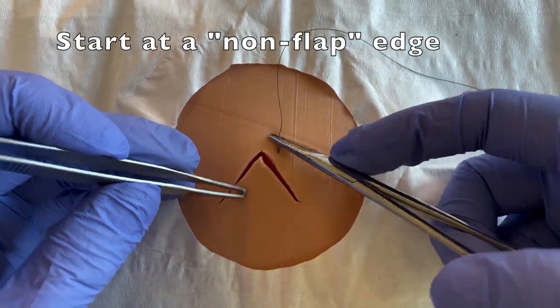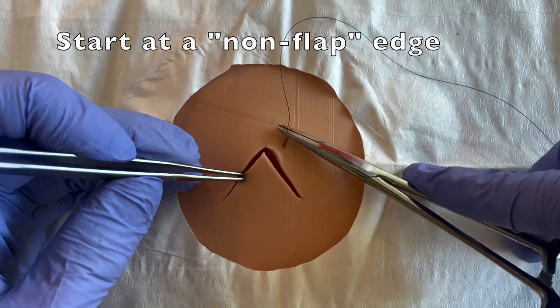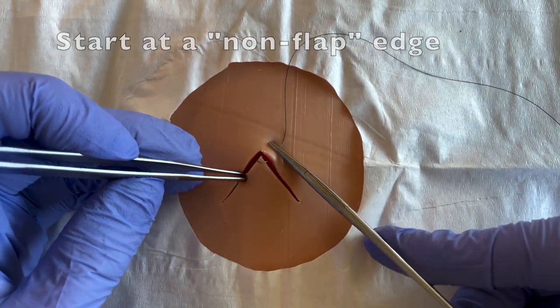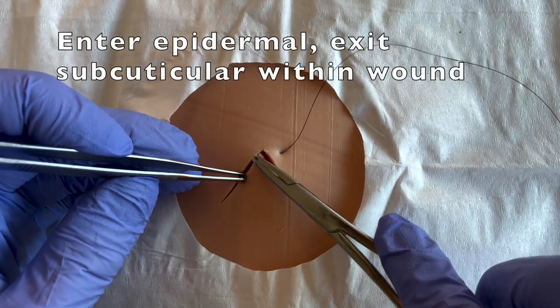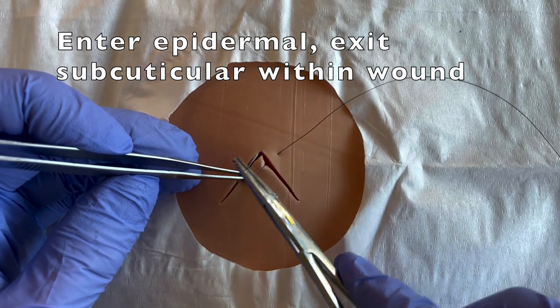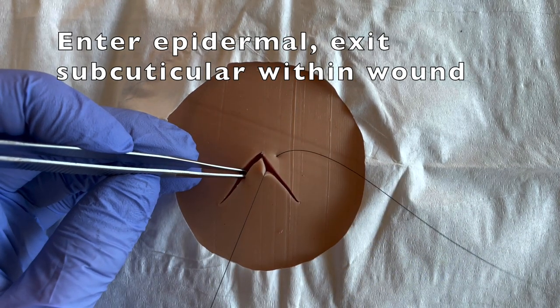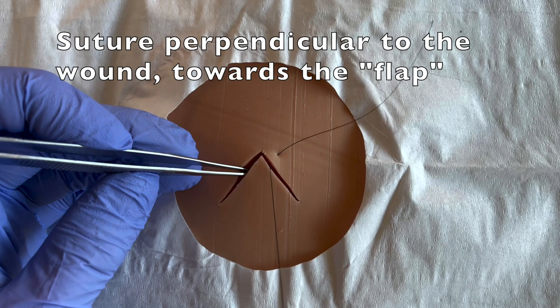Your first step in performing this technique will be to start at a non-flap edge of the wound and you're going to suture epidermal to subdermal, suturing perpendicular to the wound towards that flap edge.